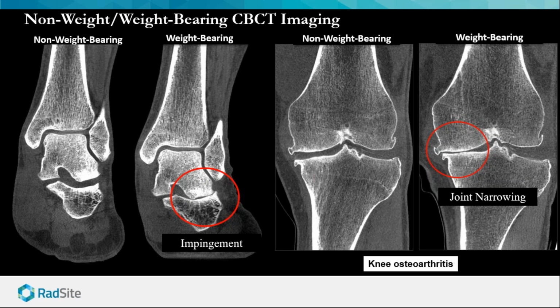So this weight-bearing capability is garnering significant attention, most importantly at the moment in the foot and ankle and podiatry communities, where the discussion is whether this should be the standard of care going forward if you have the ability to image in these kinds of configurations.